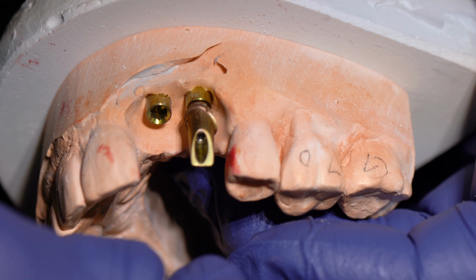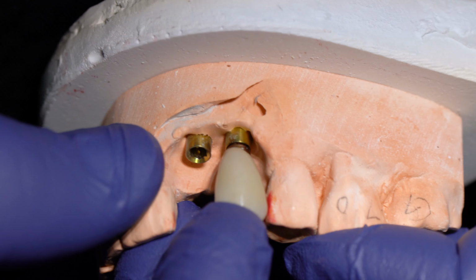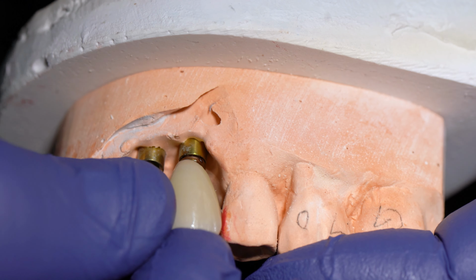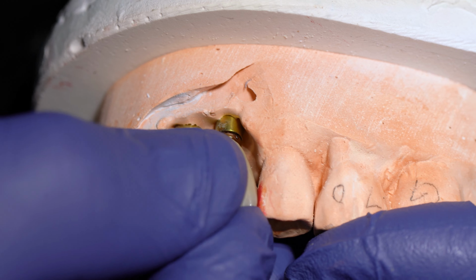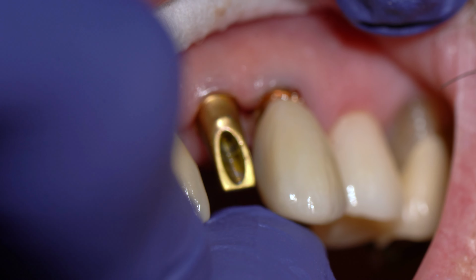So I'm going to go back and put it on the model to see if it seats the same way. As I'm seating the crown, boom, it seats all the way. So on the model, this is seating all the way, but in my patient, it's not seating all the way. That means my model is inaccurate. Something got rotated when I sent it to the lab. See, it's not seating all the way.